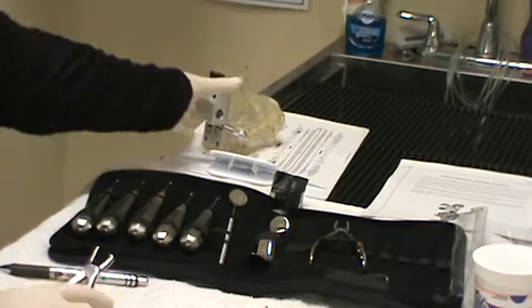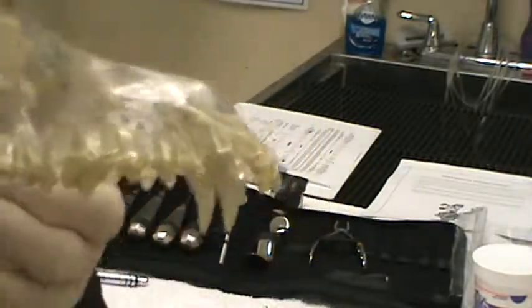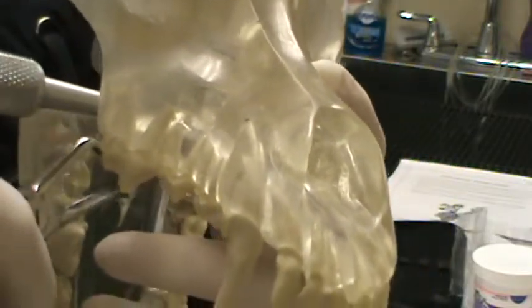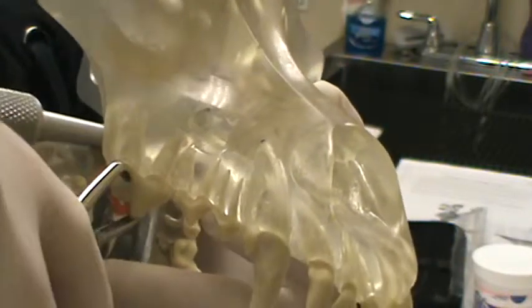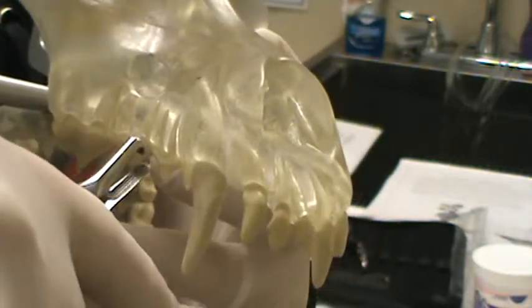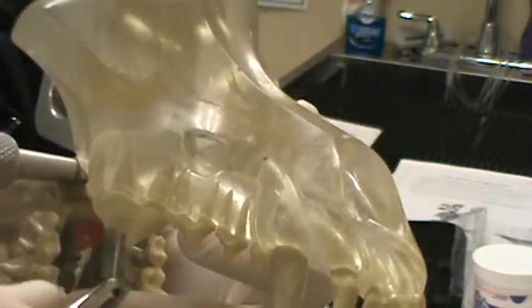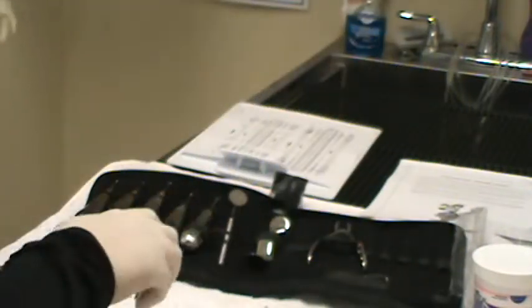I'm going to go over the use of these instruments on our model. There's usually a lot of tartar on these upper PM4s. If it's really thick, you're going to take your tartar chippers, rest them on the crown, and go from the gingiva down to the tip of the crown — just that little crunching motion to chip away at large amounts of tartar. You do want to be careful: any rocking motion can start to elevate that tooth and make it wiggly. Keep the correct angle, go straight down, and be careful not to injure the gingiva.